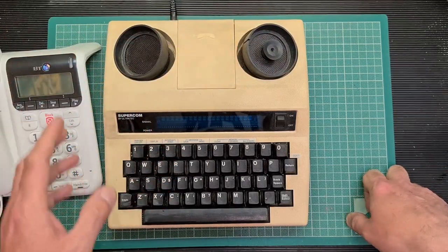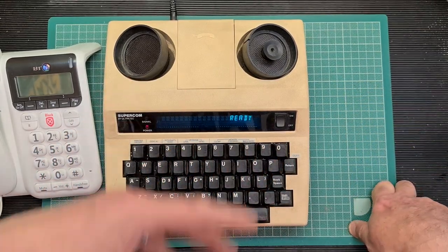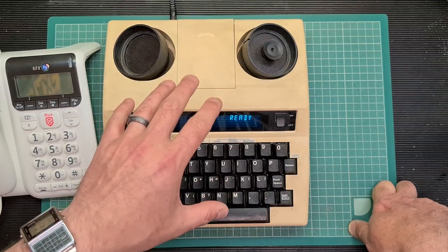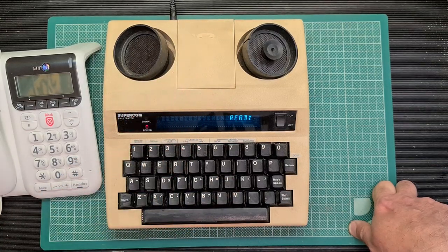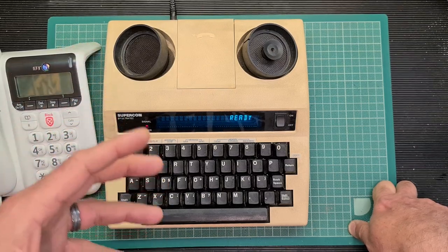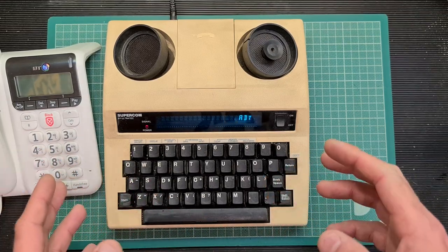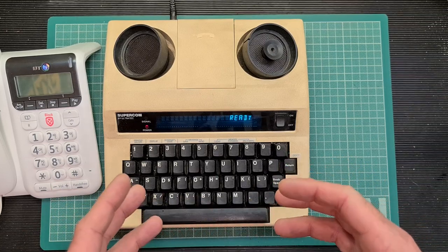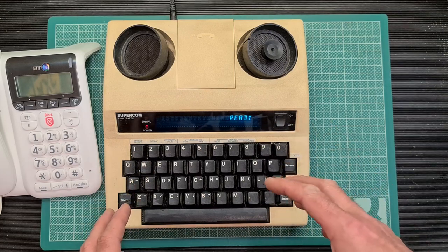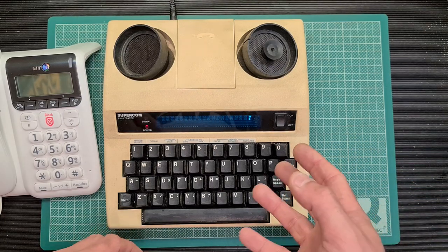I'll turn it on — it just comes up ready, gives us a little beep tone. If you were calling a friend who is also hard of hearing, they would of course be expecting to use a device like this. However, if you were calling a business, it was quite common back then for those businesses to have the facility to use teletype. And you could indicate to the business that you were hard of hearing by using an announcement function, which this device does have.